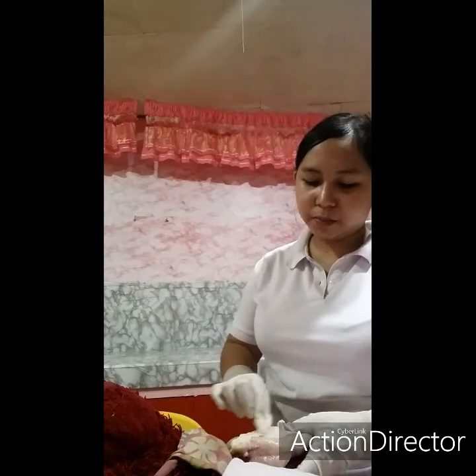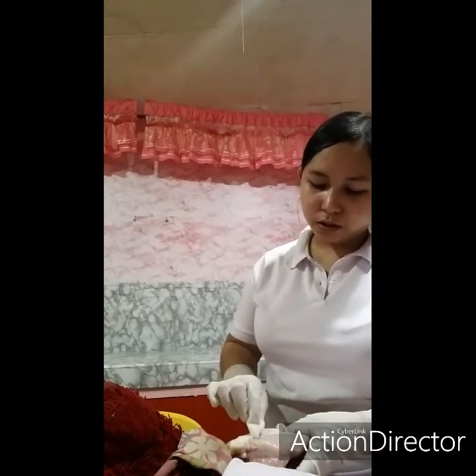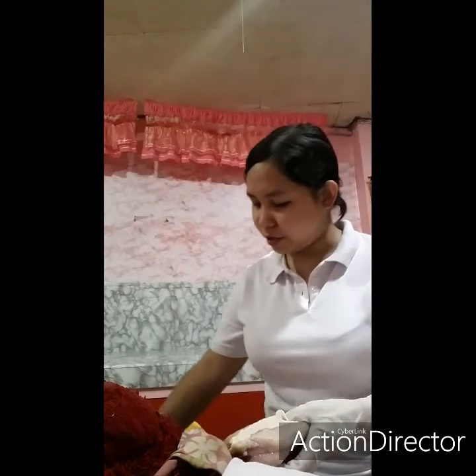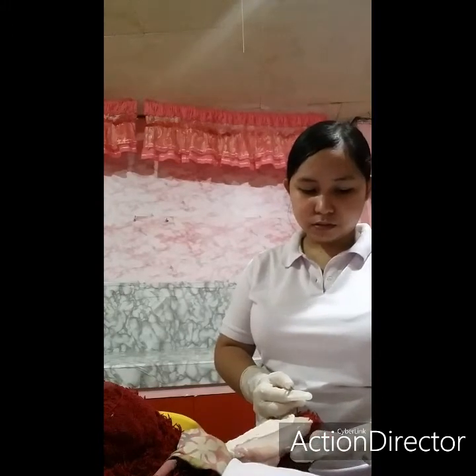For the injection, clean using a cotton ball with antiseptic alcohol from in to out, in to out. Then discard. And now, uncap the needle.